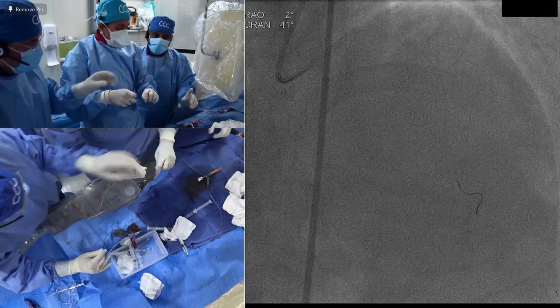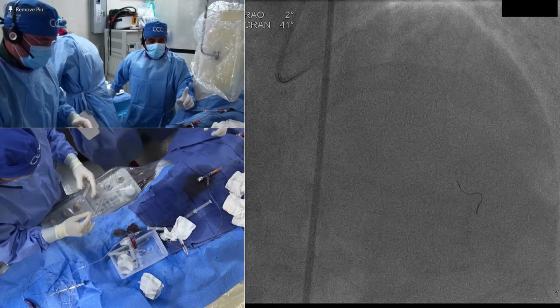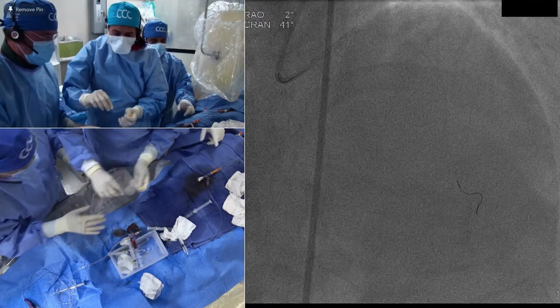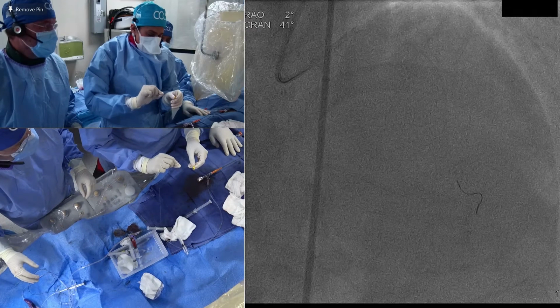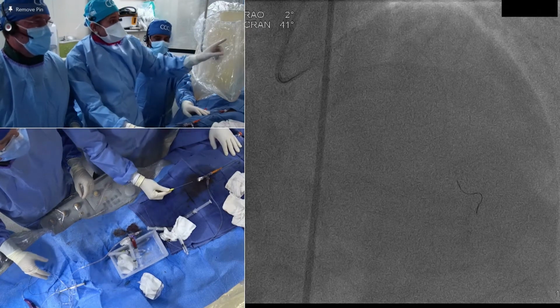No, that was PDA and OM. Previous stents in the PDA, circumflex and OM had been done before. At that time you had a discussion, right? Yeah, he did have a discussion before, at 3-vessel disease, when he was diabetic with 3-vessel disease, and it was decided the same. They were spot lesions. I think that's what we need to revisit.